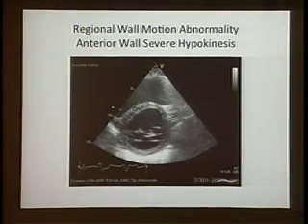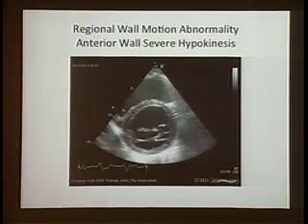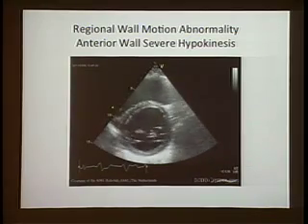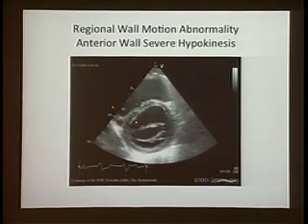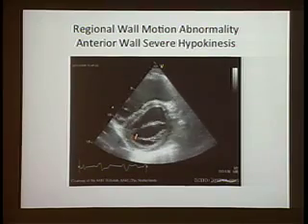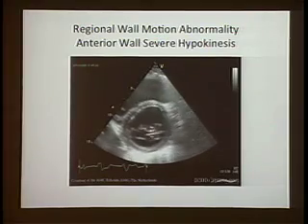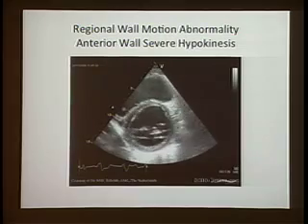If you have someone that didn't have a wall motion abnormality before, and now you come in and you see something like this, where this wall here is barely moving. Just pay attention. The heart vibrates a little bit, but also this wall is not thickening at all. You see how this wall is moving in and thickening a little bit? Here you don't have that. By the way, this is the mitral valve. This is one of the extended views. Okay? And again, there's a funky movement here between the septum, and you can start asking me, well, what's the right-sided pressure? I'm not going to go into those details. But again, you should be able to pick up this.